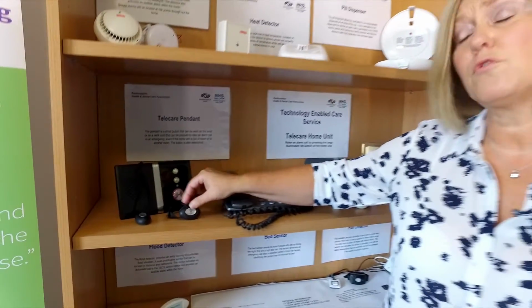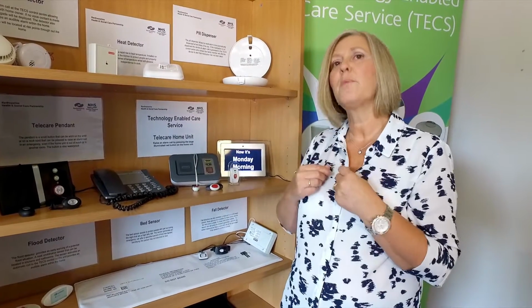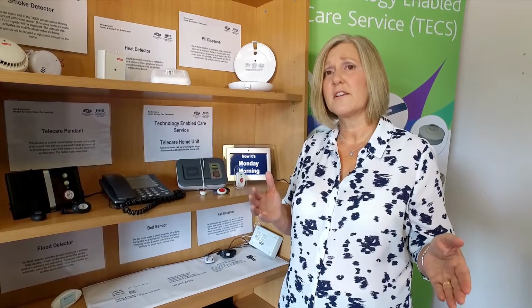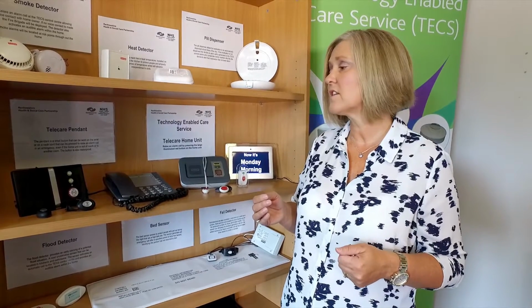Another thing to point out about a basic community alarm is the actual pendants, believe it or not, are waterproof. So you should never ever take your pendant off during the day. We have a common mantra that we would say to people, and that is that before you get your legs out of your bed in the morning, put your pendant on. It's at those times of the day that we're going to have our fall. When we're getting out of bed in the morning, we're all feeling a wee bit sluggish. So we need to make sure that in leaving the bed, we don't have that accidental fall. And if we did, we've got our pendant on us that we're able to press for assistance.